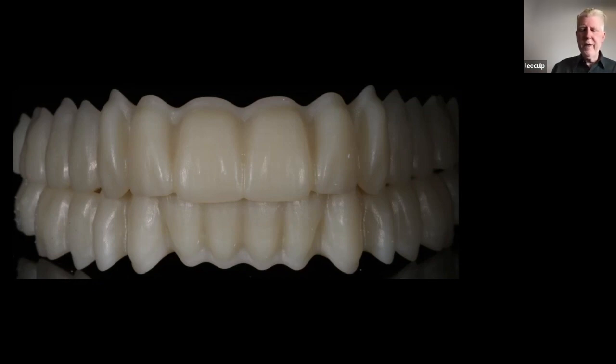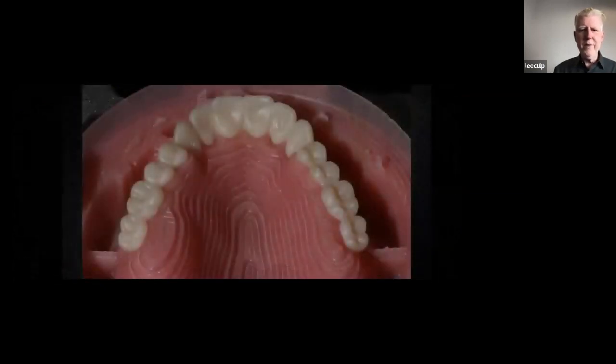So this is how the teeth start. And even though there's pretty decent tooth separation between the teeth, they're still bonded together a little bit because the burrs just can't get way down in there to fix that. And they fit like a glove.